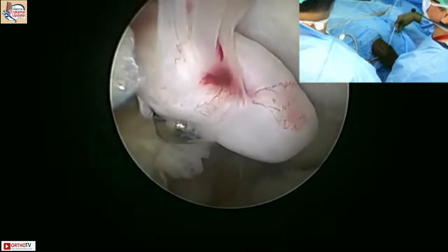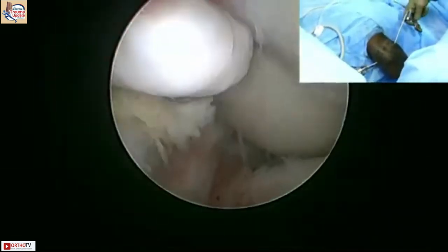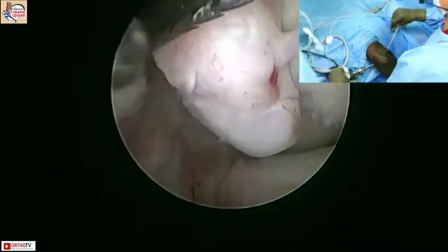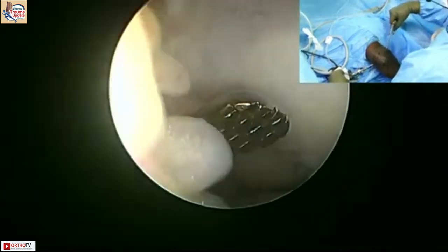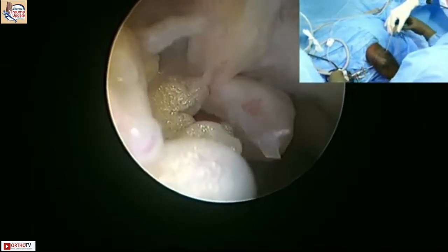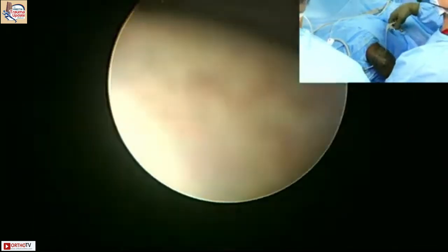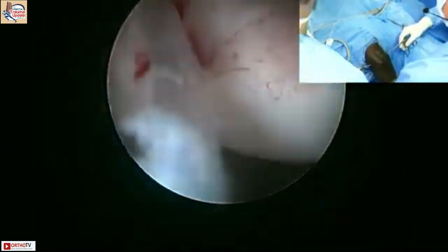So this is the one we looked at on the scan. Yeah. Oh, come on. So again, you can see it's attached all the way up, so it opens fully. Okay, hold this. Don't pull the elbow, because it makes my life really, really difficult.